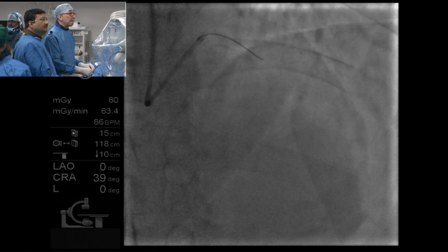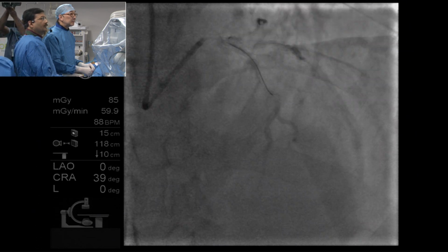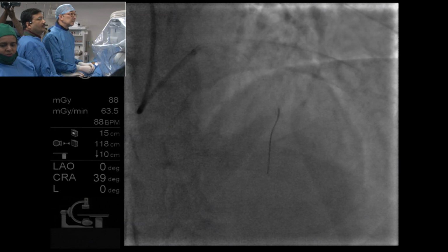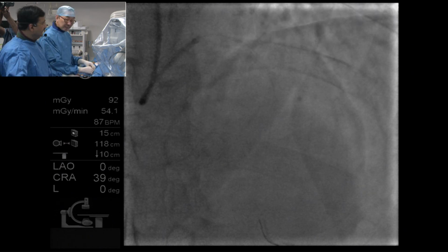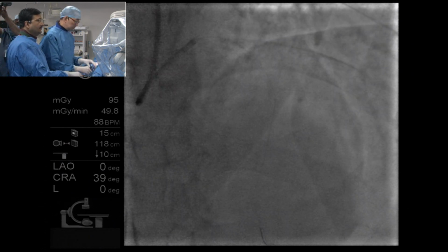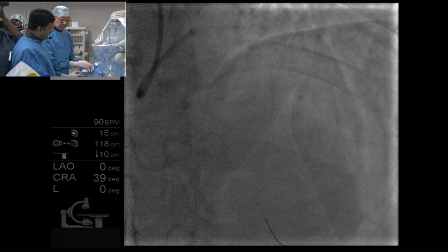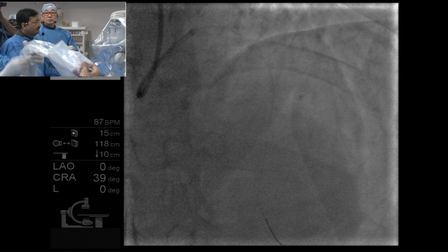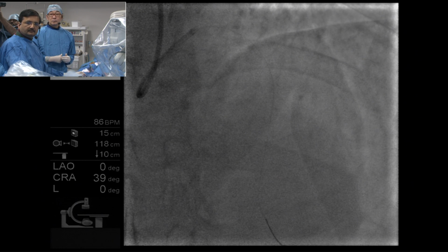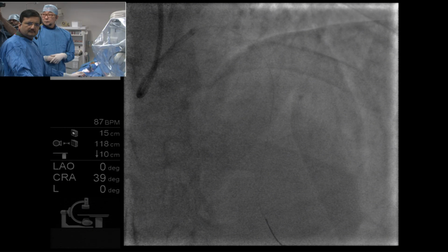There are two multicenter trials, OPINION and ILUMIEN 3, showing non-inferiority of OCT-guided compared with IVUS-guided PCI. But they were planned to demonstrate non-inferiority. We are expecting some superiority of OCT. There are some advantages and disadvantages to both modalities, as you may know. But if you focus on a specific condition, for example a severely calcified lesion or a bifurcation lesion, I think OCT may have some advantage compared with IVUS.